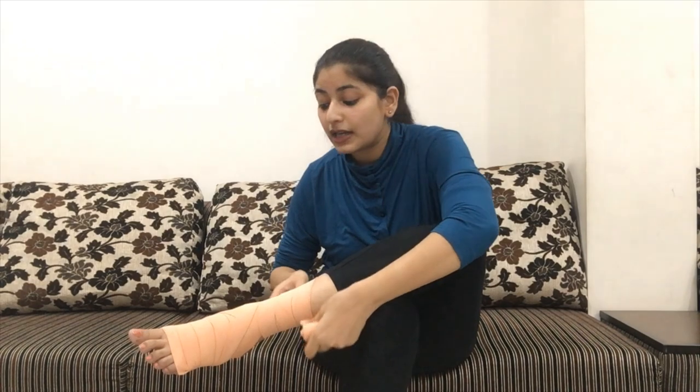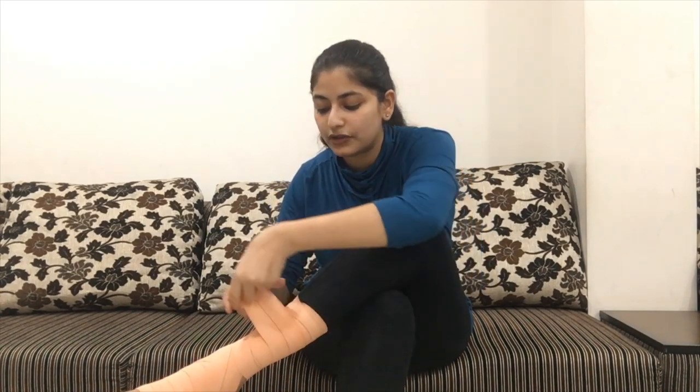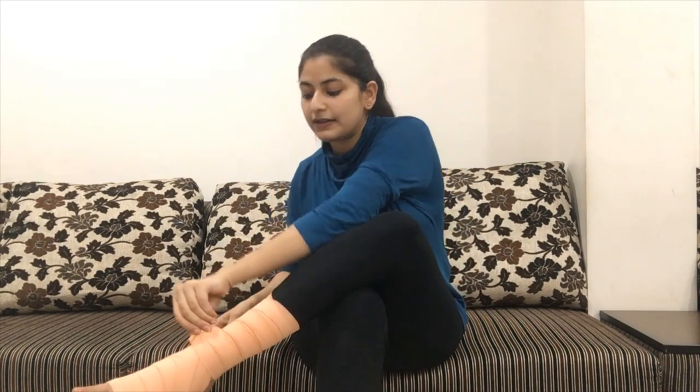Ab yeh pura bacha hua jo bandage hai, ya toh aap pura upar tak roll kar sakte ho, ya toh isko aap isi ke baad mein neeche le ja sakte ho. So what I am doing here is I am just making a cross pattern here, and finishing off the rest of this bandage. Finally, isko yahan pe hum anchors ki help se — jo iske saath milte hain, kuch aise hook-jaise structures hote hain — hum usko finally yahan pe tie kar dete hain.